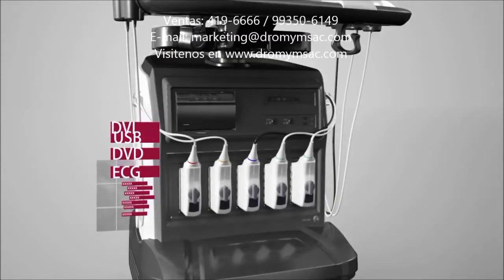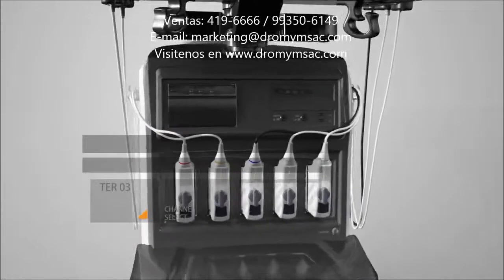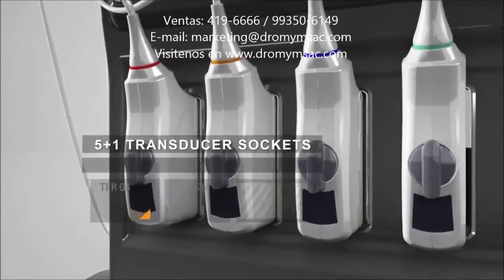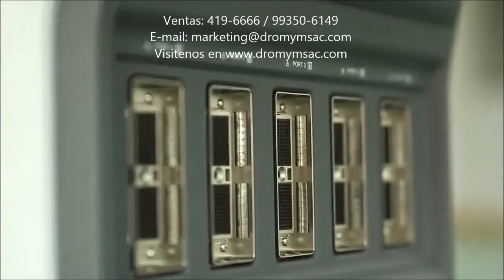DVI, DVD, USB, ECG — multiple interfaces provide convenient user data solutions. Five plus one transducer sockets support multiple connections and extension, available for all Sonoscape transducers.